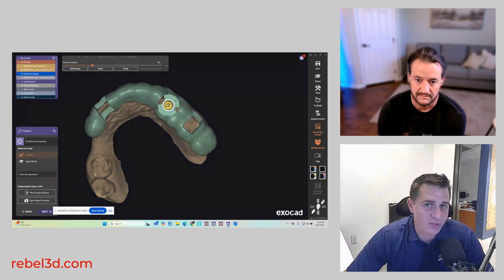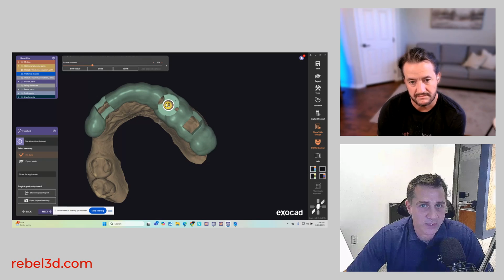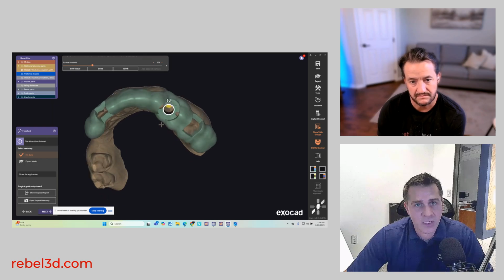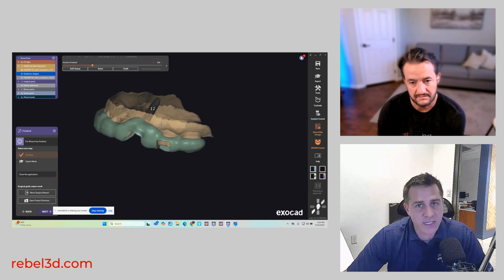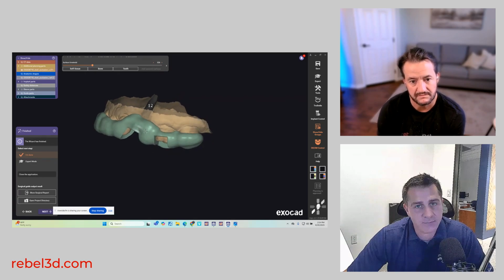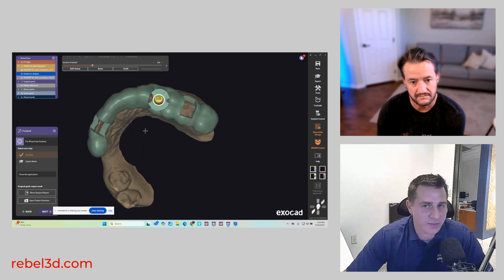And then vice versa. I thought, okay, it looks like this is going to be some soft bone, and I had to really adjust things just to get the implant in place because the bone was so dense. So I don't think our CBCTs today are as accurate as we'd like. They're not 100%, and you have to be able to alter things as you go, and that just comes, I think, with experience.